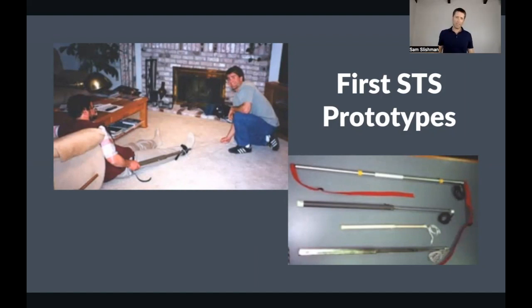I put this picture in because I'm smiling there because this is the first time I've applied it, and that's my dad's leg. First time I applied it, it looks like it is working well, but the better picture would be probably 10 or 20 minutes later. If you see here, I had a hook on this side, a hook on this side, and it was not a light bulb moment. It was more just like, can we just flip it?